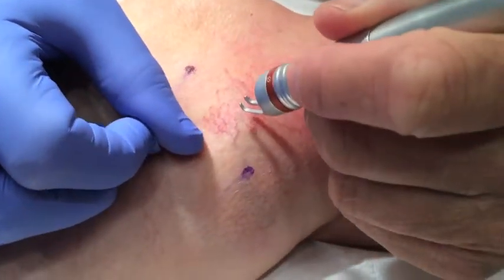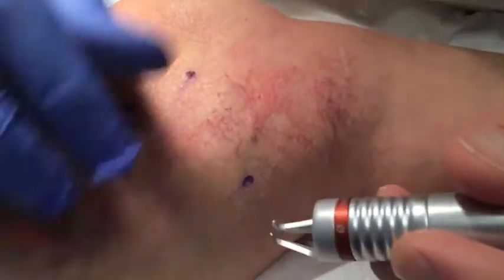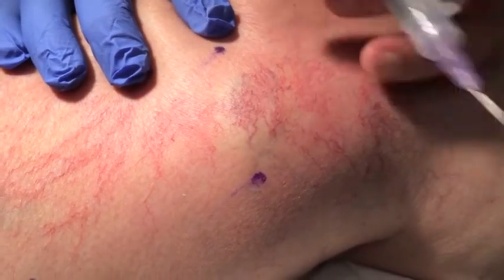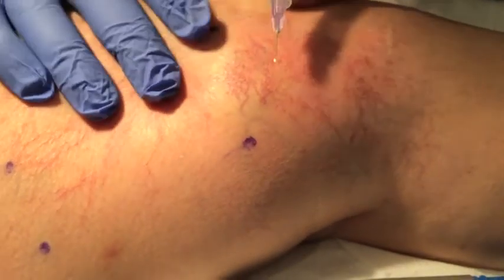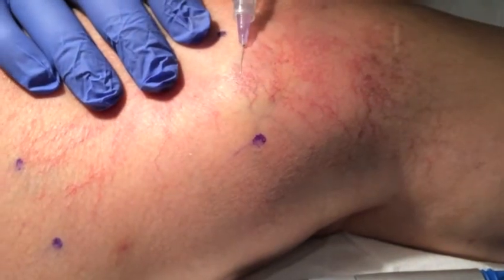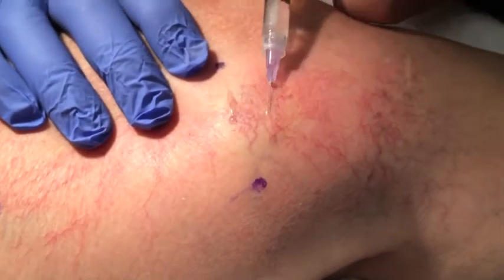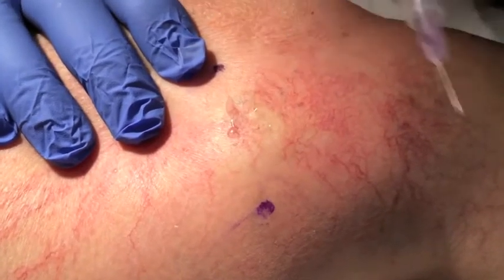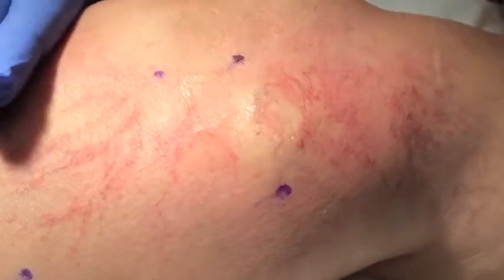A little bit of blood volume there — I want to get right out. Now you can see a lot of the blood volume is gone. Since I can still see a little filling, I'm going to inject about a half cc of 0.18% sotradecol. I'm going to find a little opening, see if I can find a little vessel. See it blanch? See it blanch. So that should finish that off.